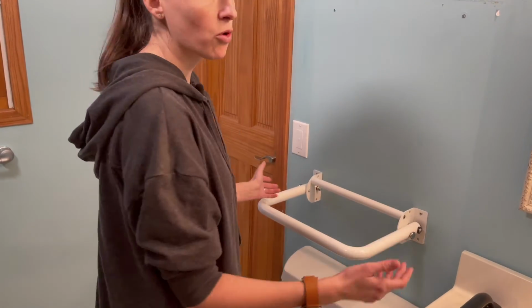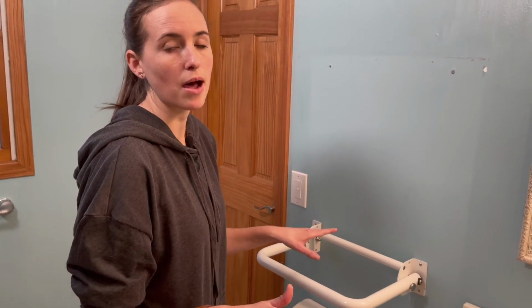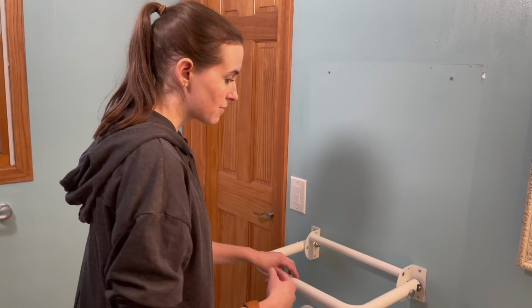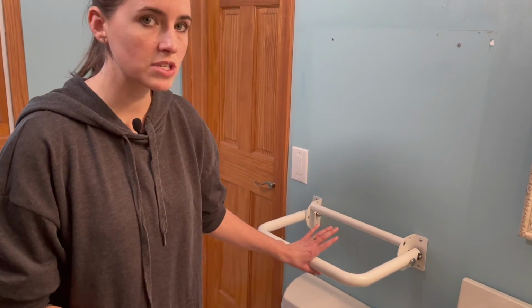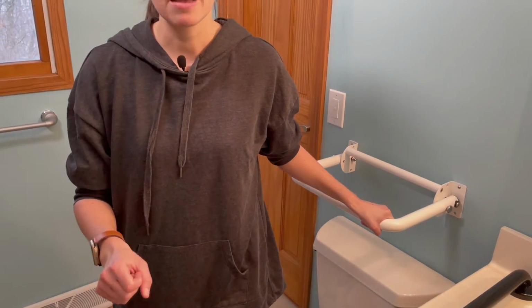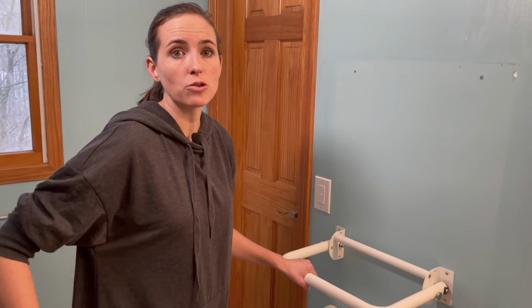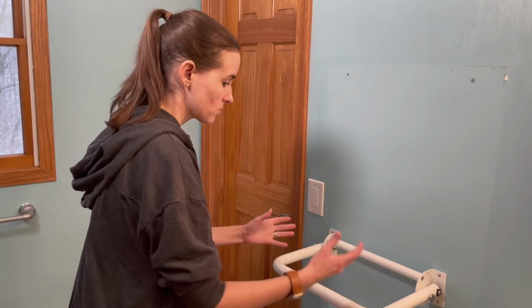And then, of course, it can be flipped up and out of the way for other users, so it's completely not a problem. I also trialed this. If you're sitting down on the toilet, it looks like it would bump you, but it really doesn't. So if I'm seated like this, it doesn't bother me or get in my way, so I can sit with it still folded down, which is nice. And then, of course, come to a stand and have this to stabilize on, perhaps when I'm doing hygiene or clothing management. So another nice feature.